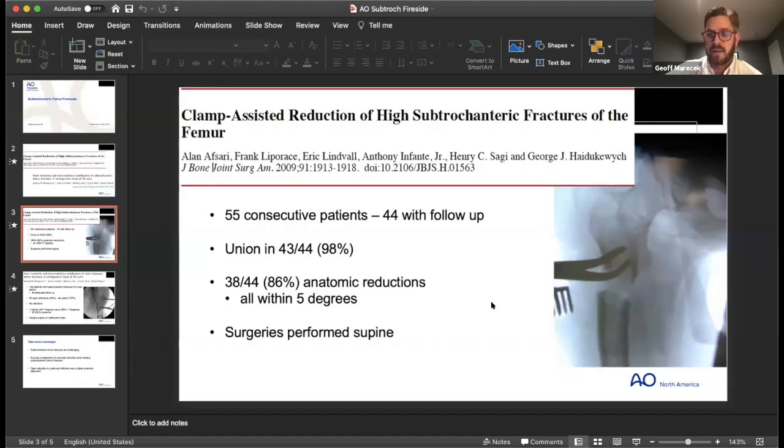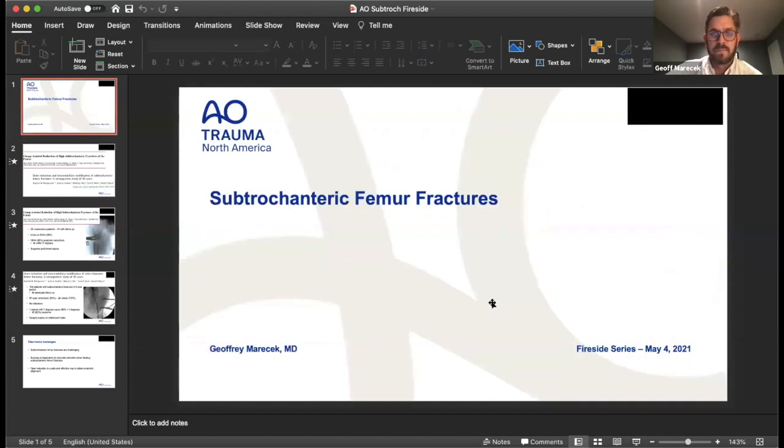I agree with you. I personally like plate assisted nailing, like you saw there. I feel like I can really tension it, and then I still get a medullary device. But I think a blade plate also works very well, whatever you're facile with. Each is not the same.